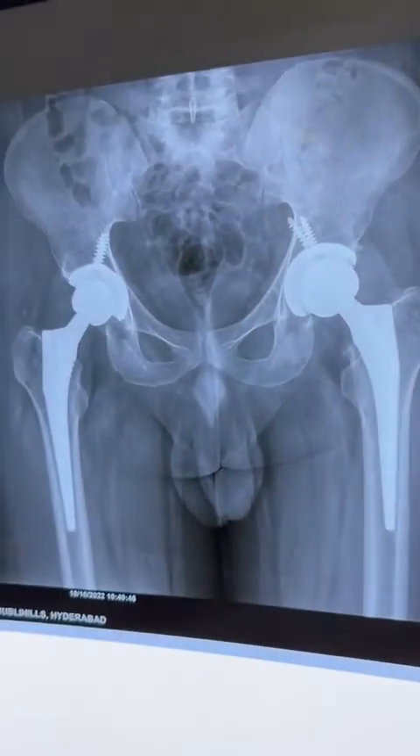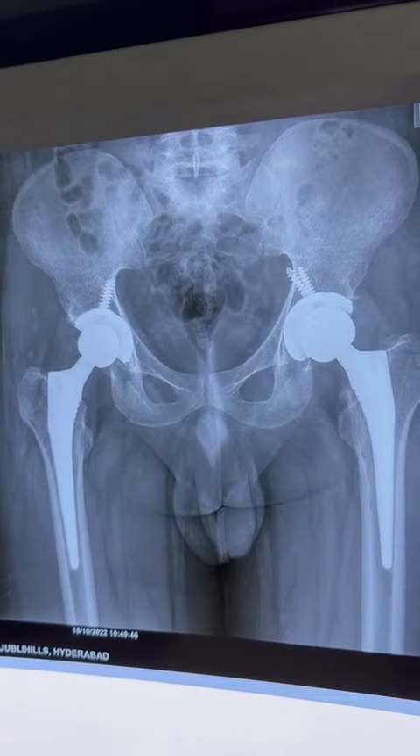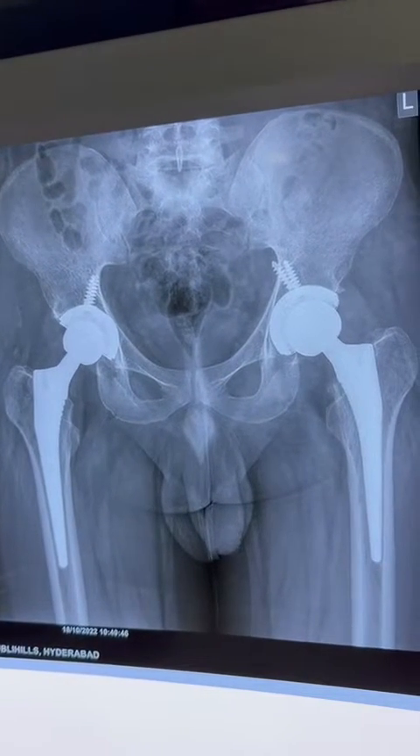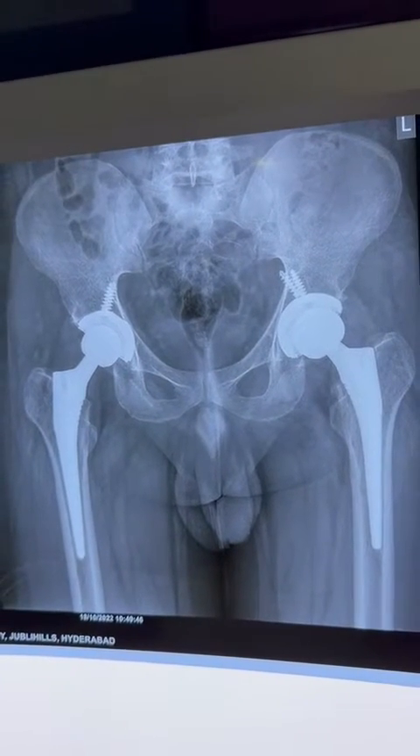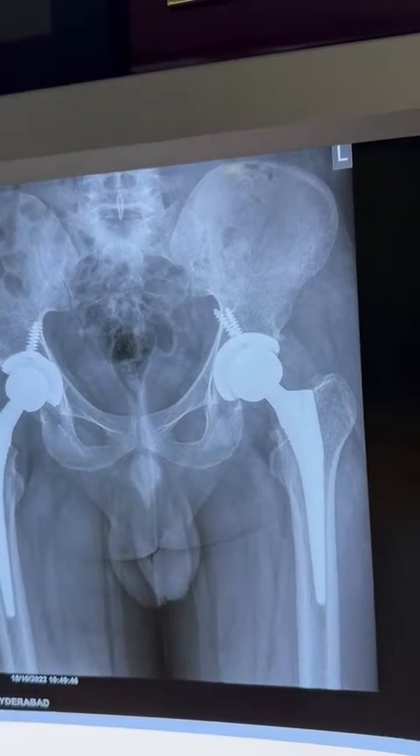Today we will discuss hip replacement — how to see post-op x-rays. These are the x-rays of a 26-year-old man who had bilateral AVN stage 4. We did bilateral total hip replacement, ceramic on ceramic. In post-op x-rays, the most important thing to assess is combined anteversion.